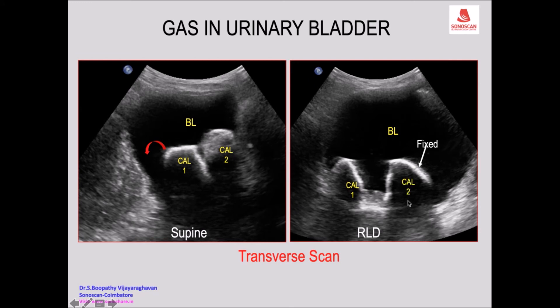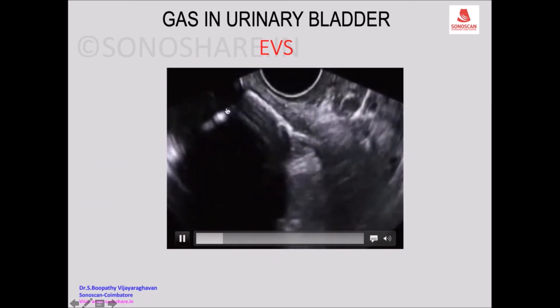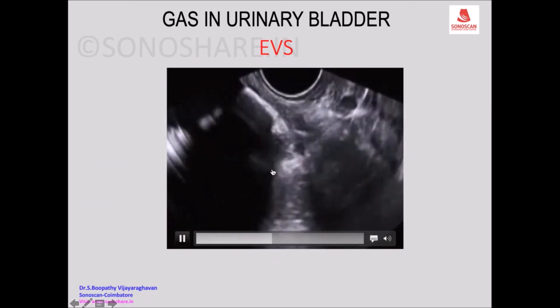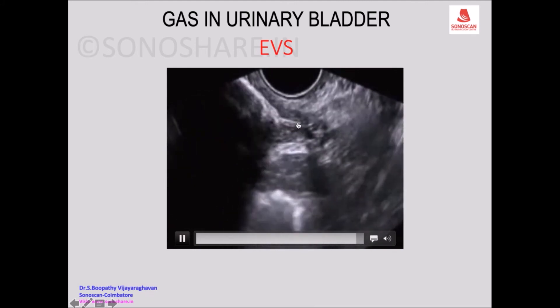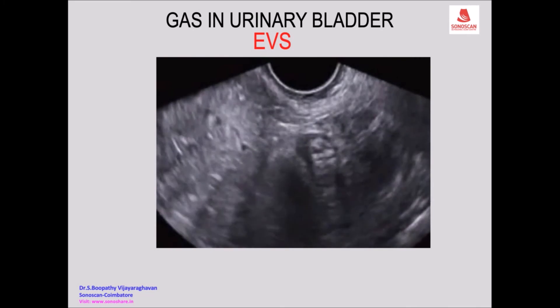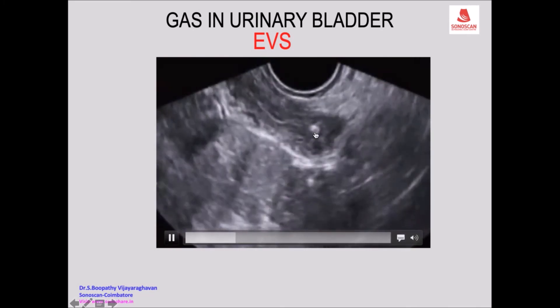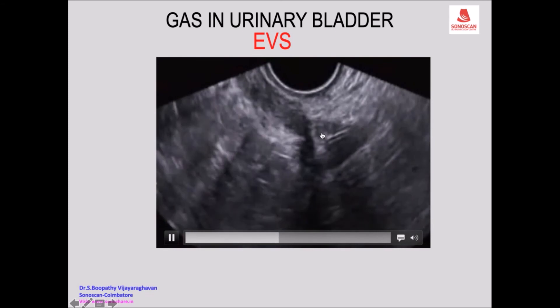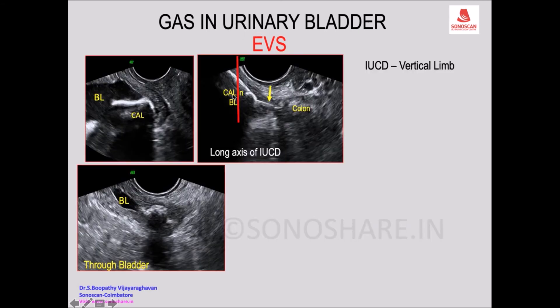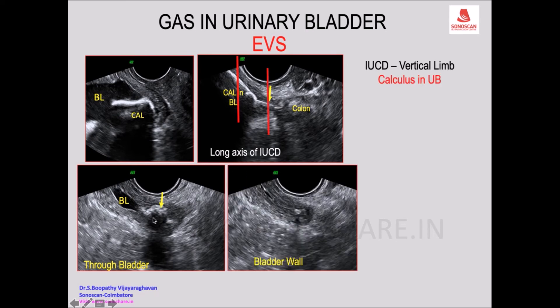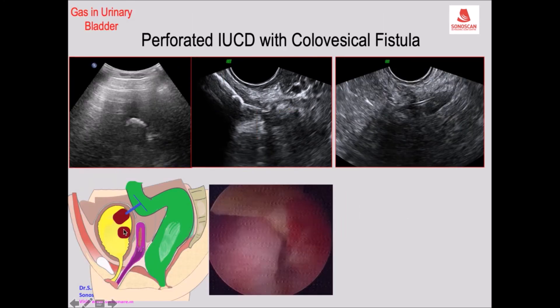On close look you see an echogenic linear structure along the axis - that is the calculus. Then you see the vertical limb of the IUCD extending through the short axis scan. The bladder is well seen, with the calculus in the urinary bladder. When you move to the next scan, you see the vertical limb, and a diagrammatic representation confirms the diagnosis.